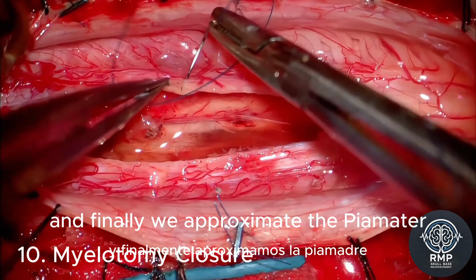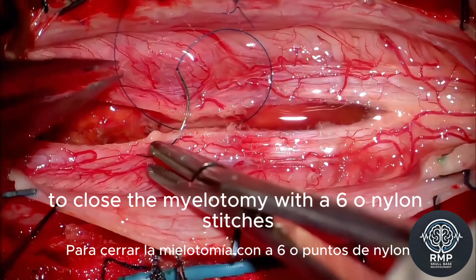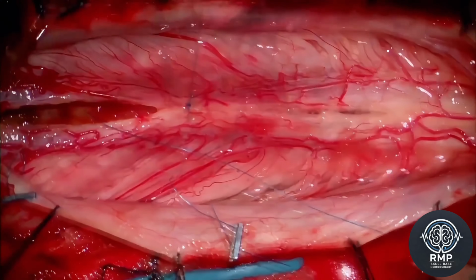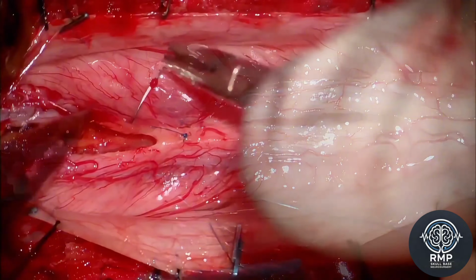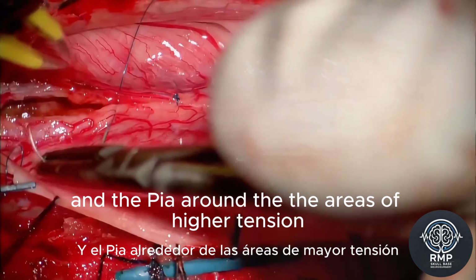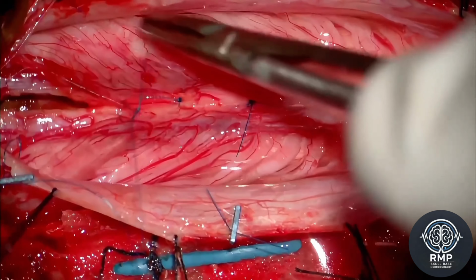And finally, we approximate the pia to close the myelotomy with 6-0 nylon stitches. We use interrupted stitches to reduce ischemia of the tissue and the pia around the areas of higher tension.